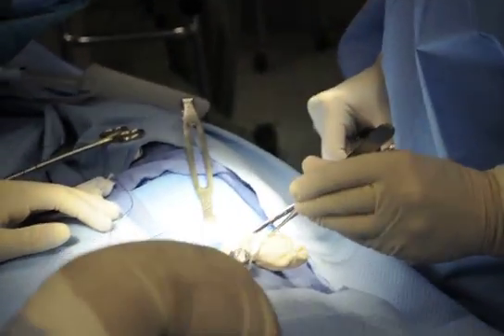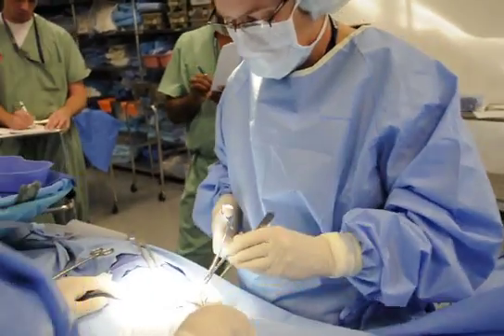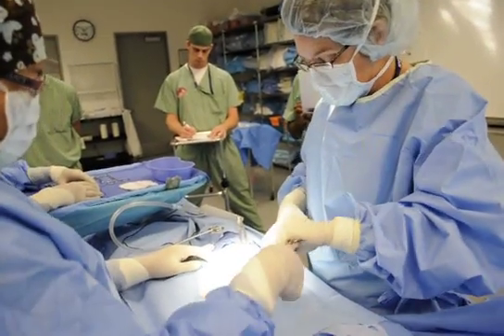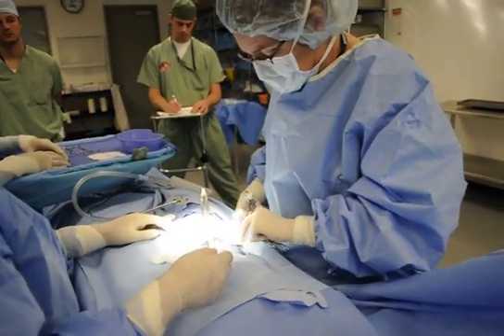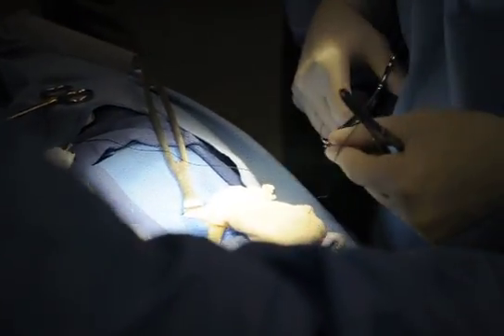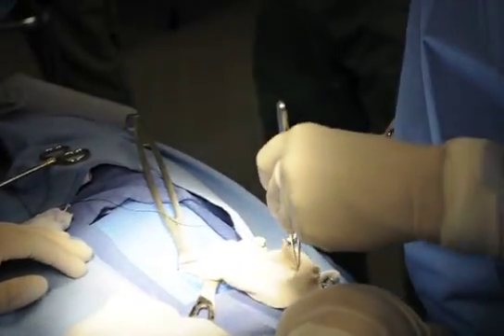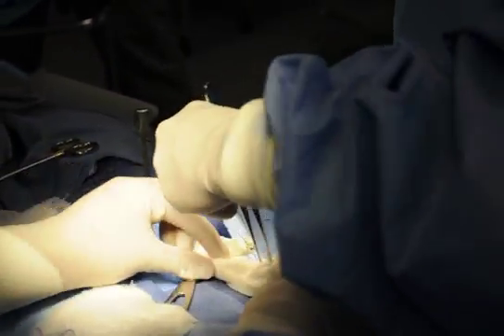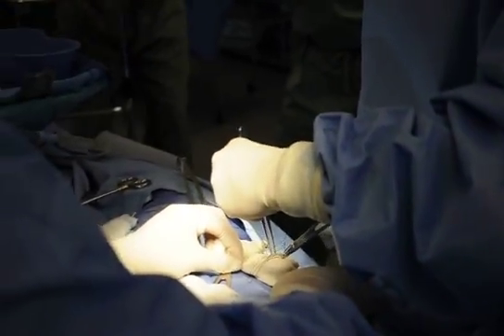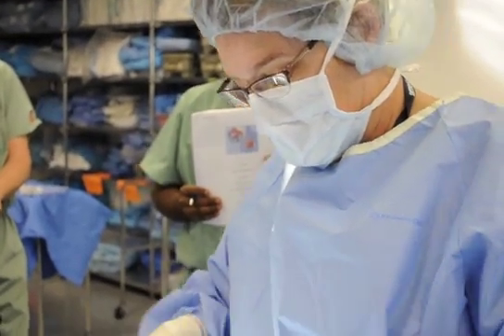So when they do the purse string, what's the purpose of a purse string? To make an opening smaller, or to close an opening. So we're going to go around this. This is just to dunk the tip of the appendix into the bell. They don't have to do this, but a lot of them do.